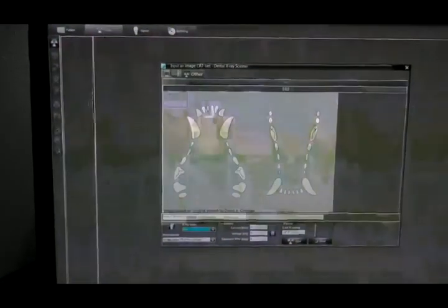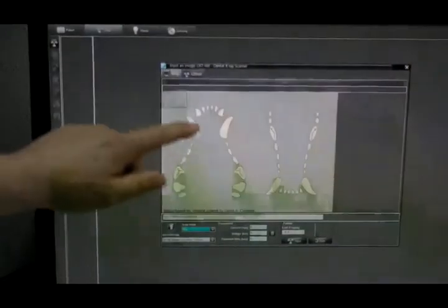To take an X-ray, you go to X-ray, and it comes up with the tooth shapes. On the tooth shapes, each tooth is named. At the top comes up with the name of the tooth, 104.